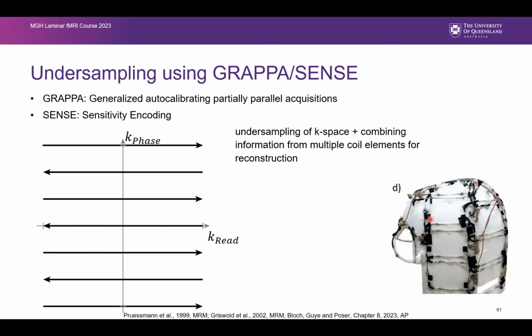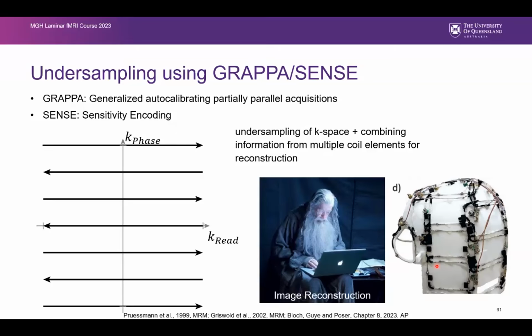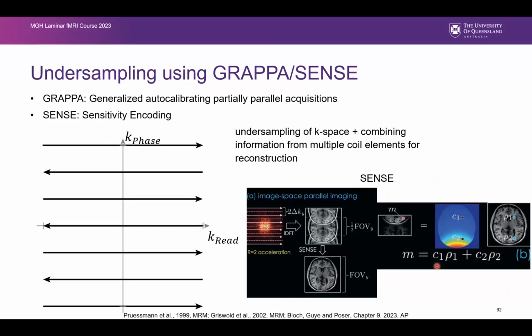I don't know how many of you have seen the inside of a coil. I put this picture here to show you these are just really electric wire, nothing more, that measure your signals. Then we apply some image reconstruction and get our images. Just to give you an intuition, as we leave out lines, we cut our field of view in half, and we get this ghosting.